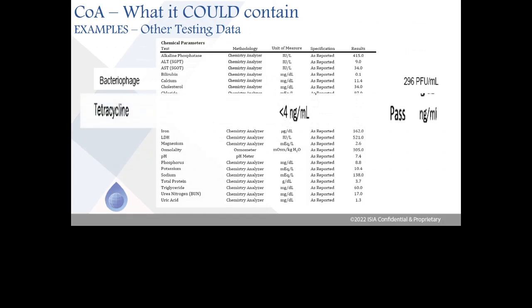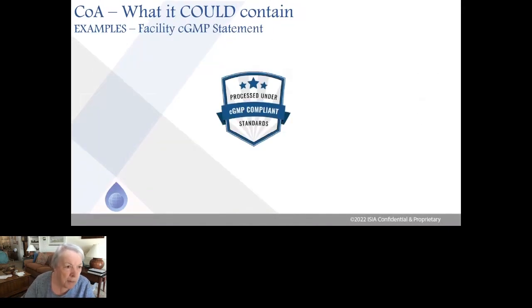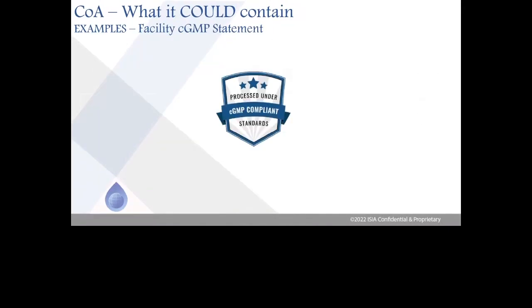Many of the additional testing will be based on end user specifications or manufacturer's internal quality release metrics based on their product codes. Finally, this is a good example of how a producer has appropriately identified their facility as CGMP compliant without specifying the serum as CGMP. Animal serum is not a product that is registered with nor regulated by the FDA.